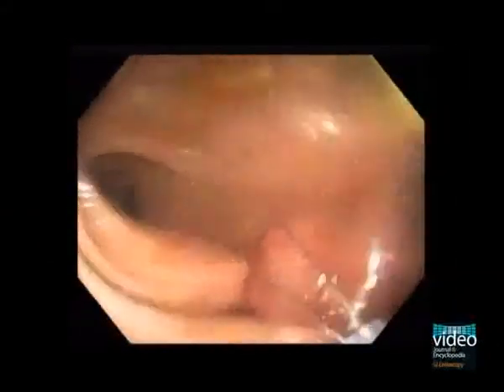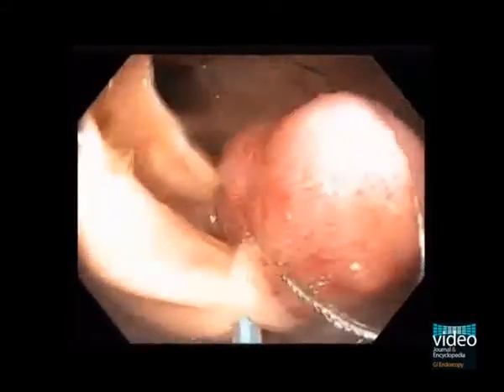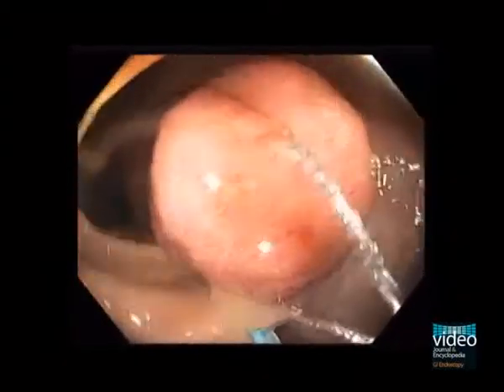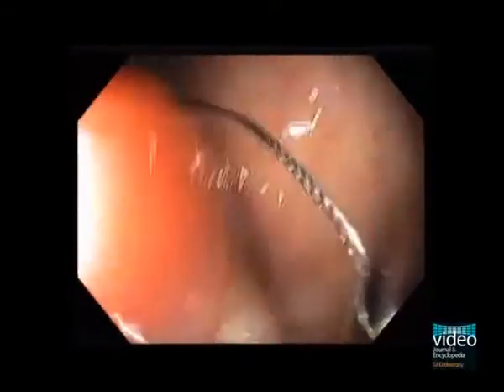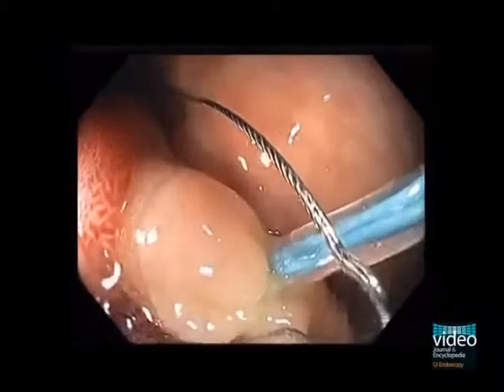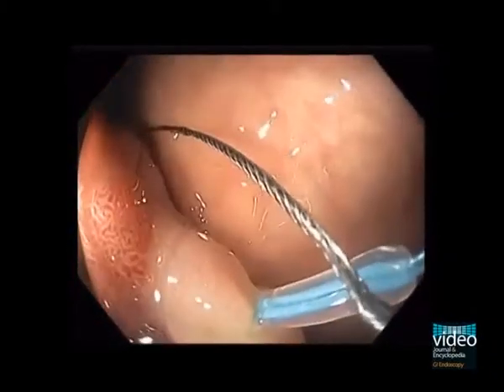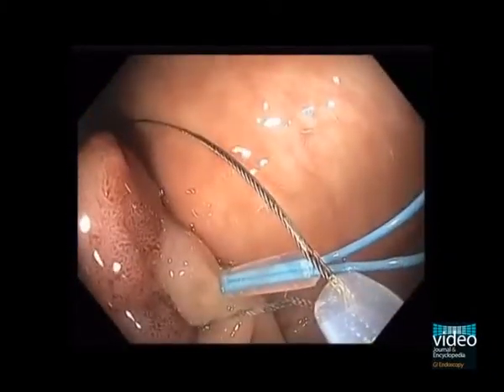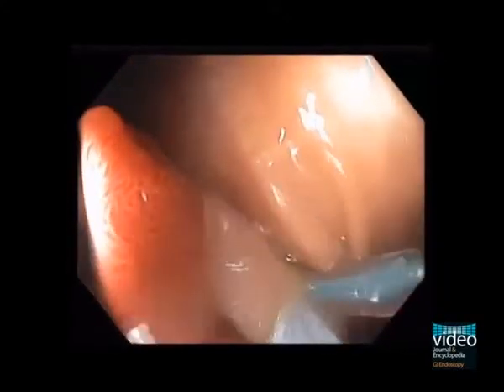A snare is passed and manipulated to bring it down over the polyp stalk. The snare is then tightened above the Enderloop and polypectomy is performed.